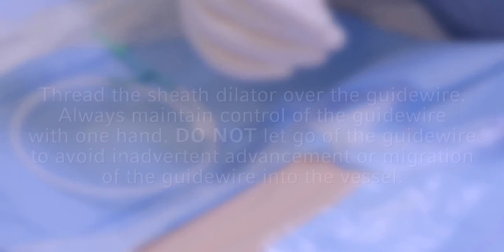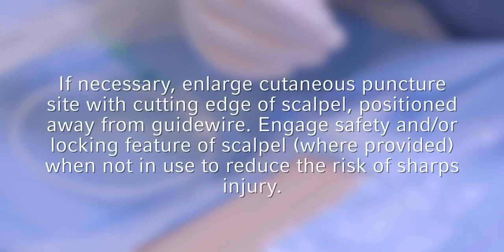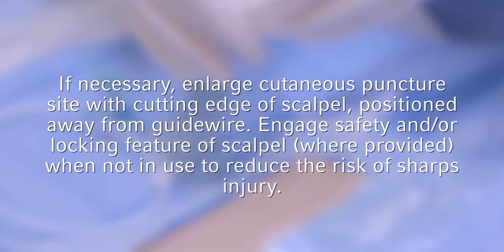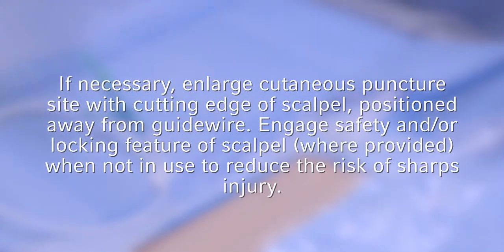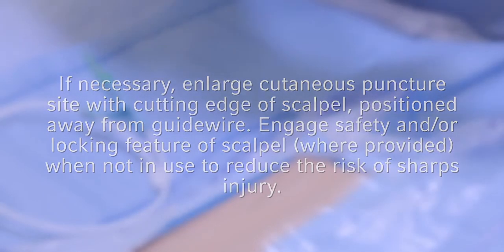Thread the sheath dilator over the guide wire. Always maintain control of the guide wire with one hand. Do not let go of the guide wire to avoid inadvertent advancement or migration of the guide wire into the vessel. If necessary, enlarge cutaneous puncture site with cutting edge of scalpel, positioned away from guide wire. Engage safety and/or locking feature of scalpel where provided when not in use to reduce the risk of sharps injury.